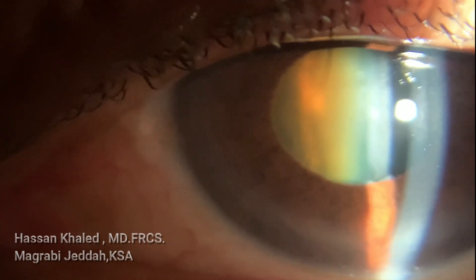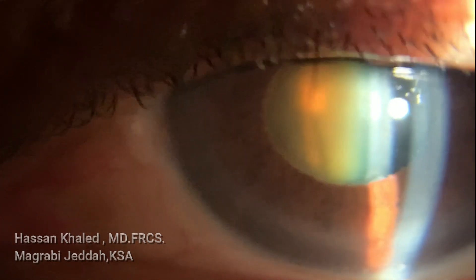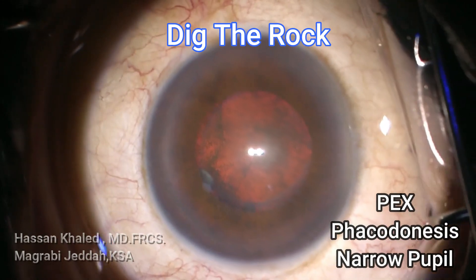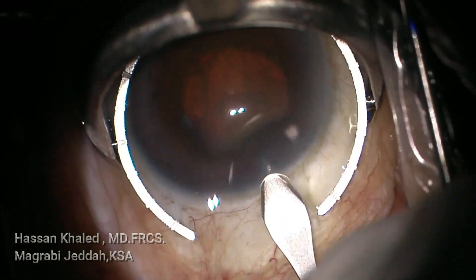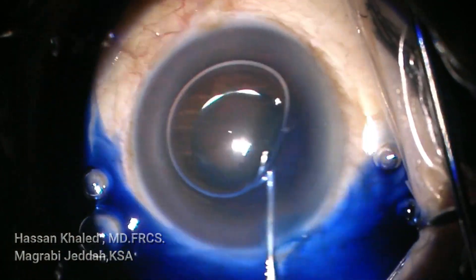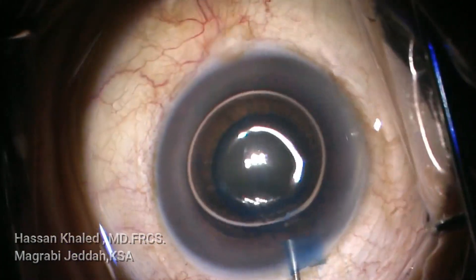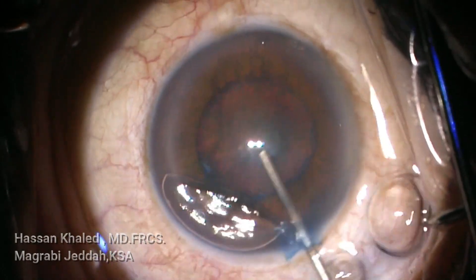Here is a case of phacoemulsification of dense nuclear cataract with phacodonesis. You can see the iridodonesis and phacodonesis through this moderate dilated pupil. You can also see the subtle exfoliation at the edge of the pupil border, with the pupil about 4 to 4.5 millimeters in diameter.